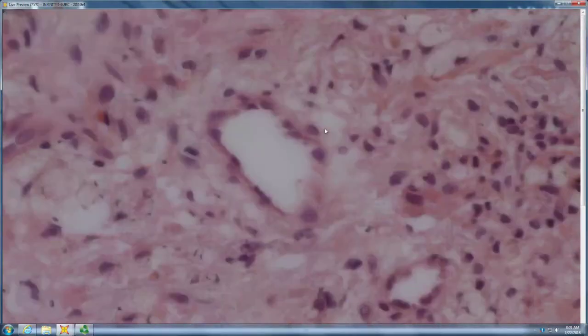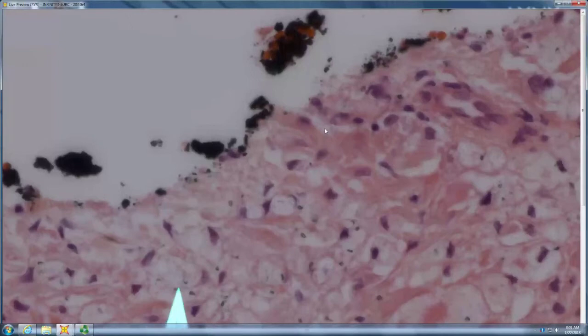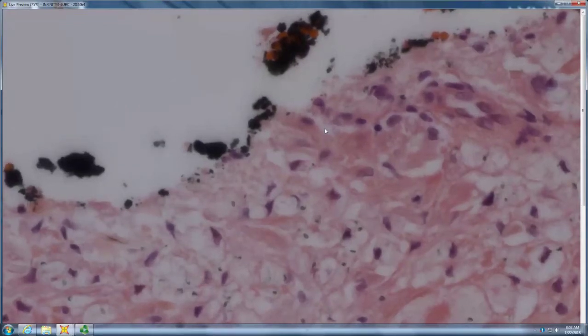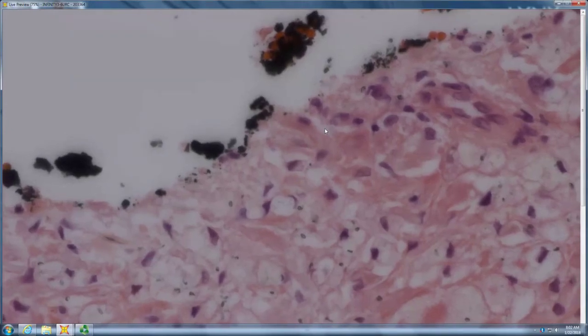So, Pneumocystis carinii, although they've probably renamed it, they're in the habit of renaming things, is often in the immunosuppressed again, and most commonly lung, but you will see it in skin, and that's what it looks like. So, now you've seen it.